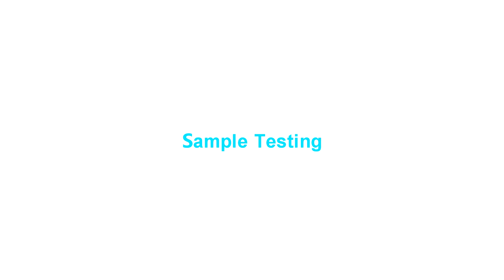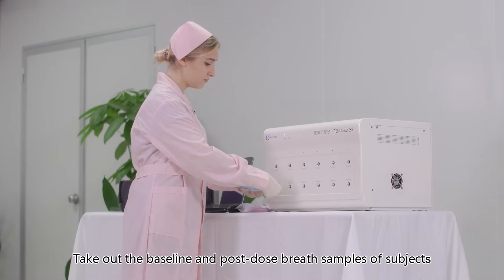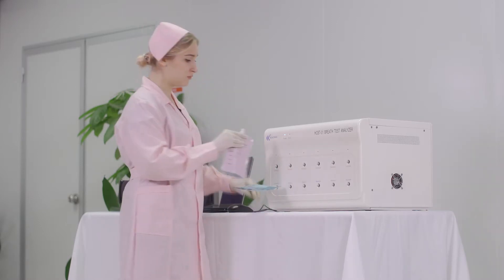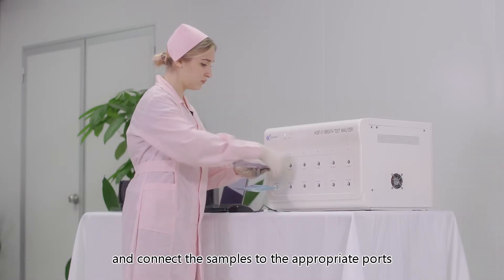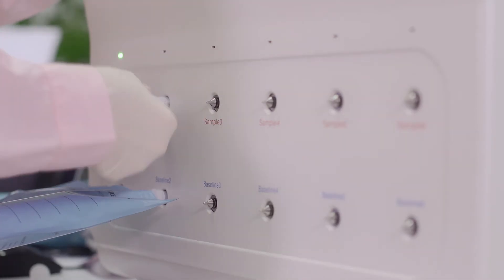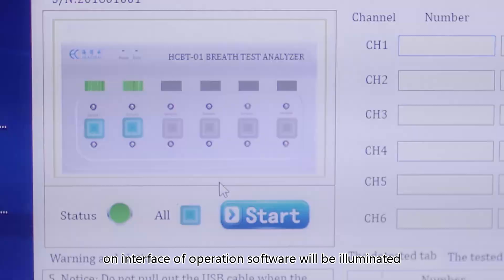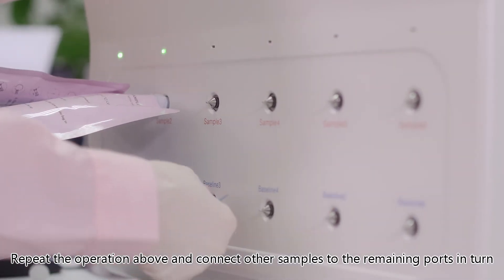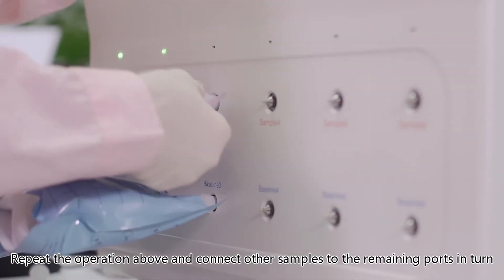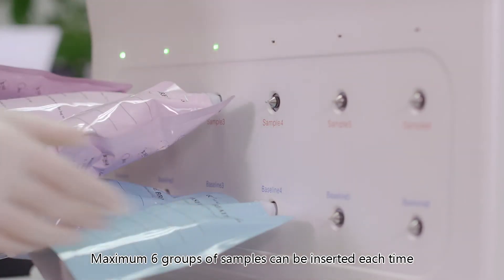For sample testing, take out the baseline and post-dose breath samples and connect them to the appropriate ports. When delivered correctly, both the port indicator and the status indicator on the operation software interface will be illuminated. Repeat this operation to connect other samples to the remaining ports in turn. A maximum of six groups of samples can be inserted each time.